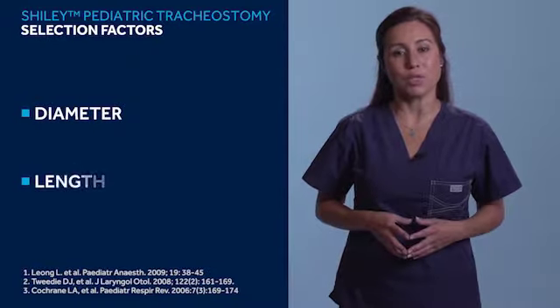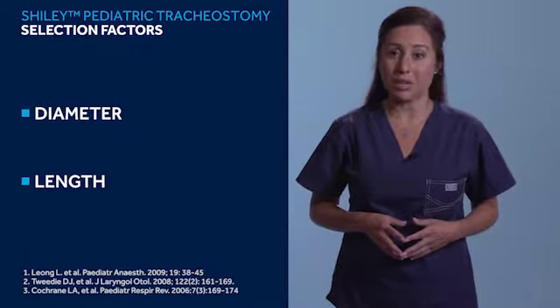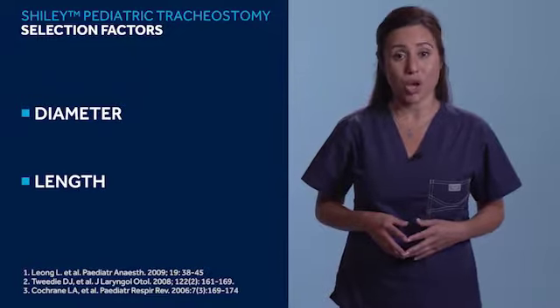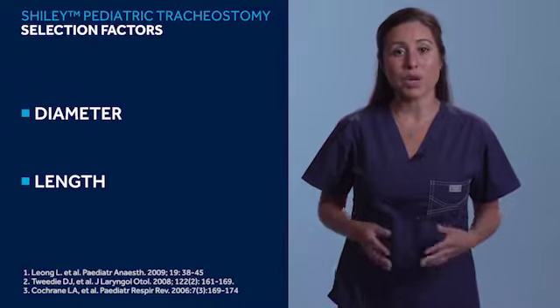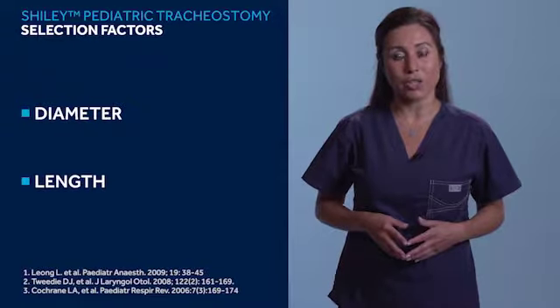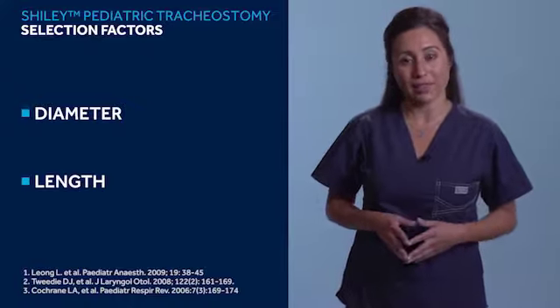The length of the tube must be selected in order to achieve safety and comfort. If it's too short, it will not remain in place. If it's too long, it may impinge on the carina. Because neonates are physically smaller than other patients, tubes designed for neonates feature a much shorter tube length.